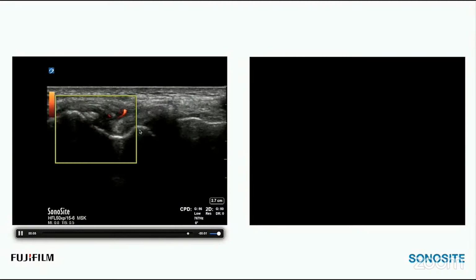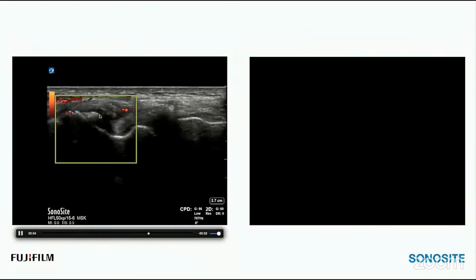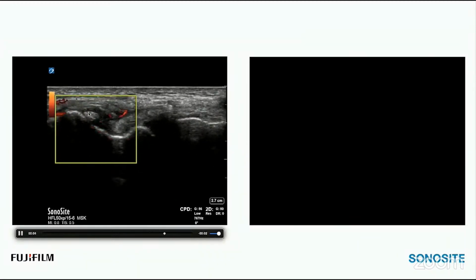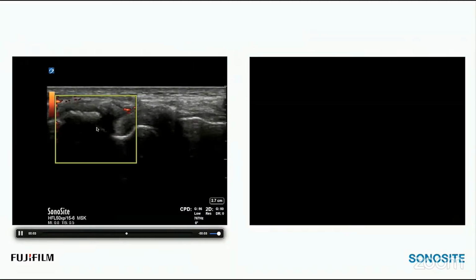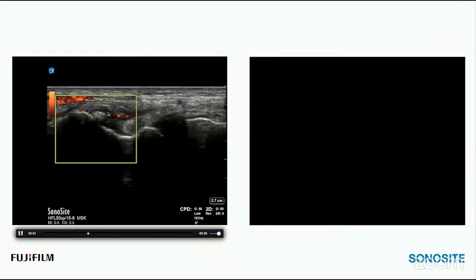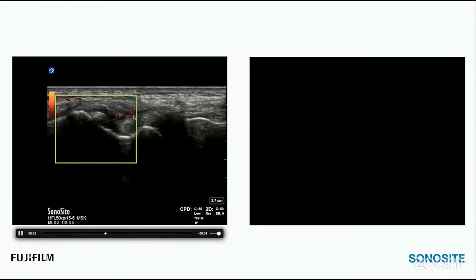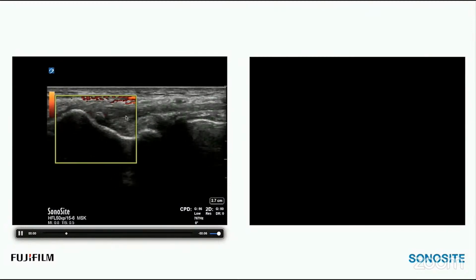So here's our popliteus groove, here's our joint, here's that lateral epicondyle. We see an old injury in the form of a smooth margined calcium deposit. Okay, so if this looked jagged and I saw some bone irregularity underneath it, I might call it an avulsion. But this is quite old, especially compared to the rest of the patient clinical presentation. This was a very severe osteoarthritic knee. So these are degenerative changes, and possibly some healing still happening within the collateral ligaments of this particular patient.